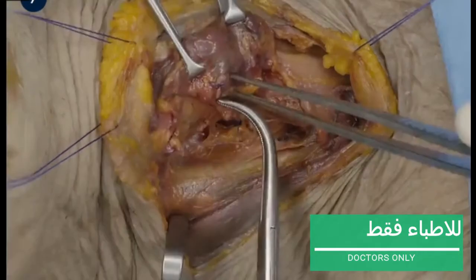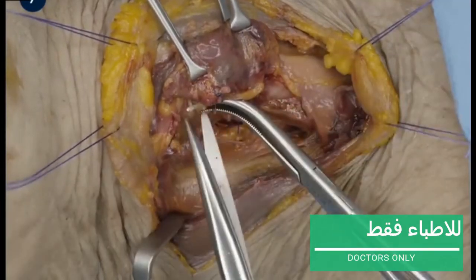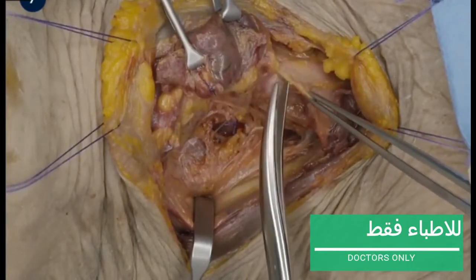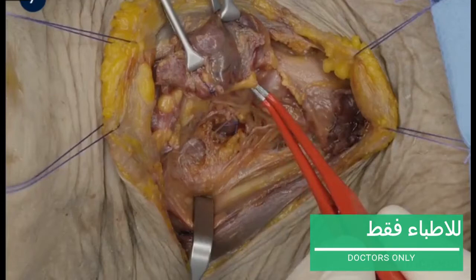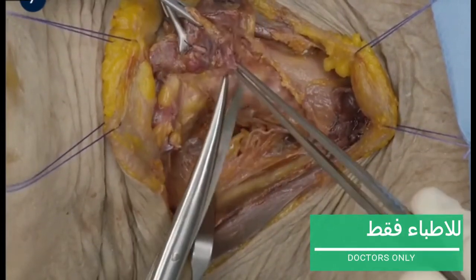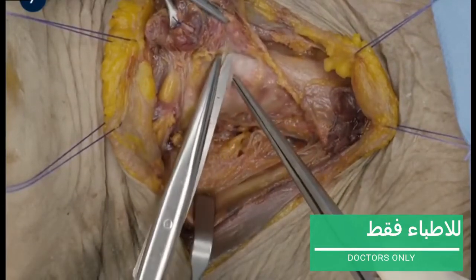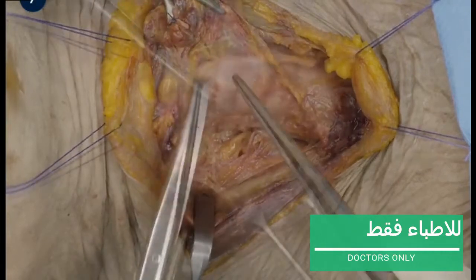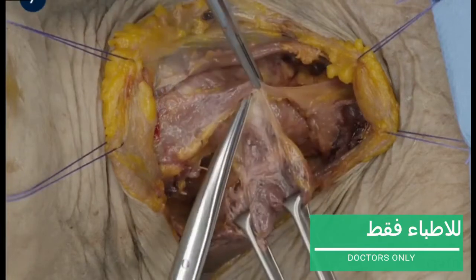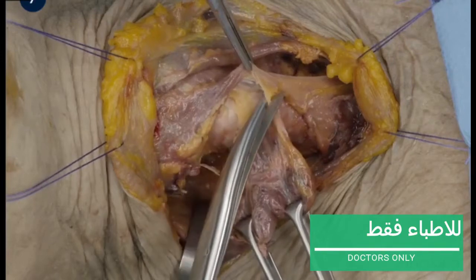The first step in detaching the thyroid gland from the trachea is the transection of the suspensory ligament of the thyroid gland. The dissection is continued right above the level of the tracheal cartilage. This small vessel often causes bleeding during detachment of the thyroid. The right thyroid lobe is completely mobilized, including the pyramidal lobe if present. Now its only attachment is the isthmus.